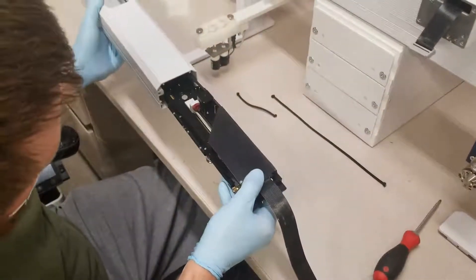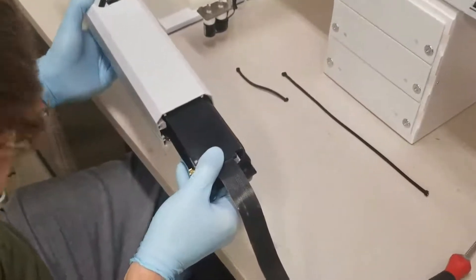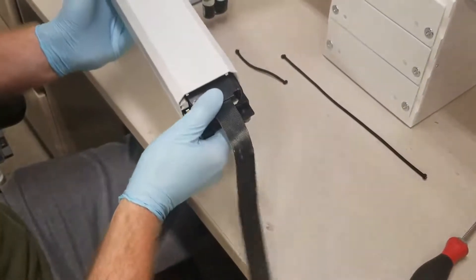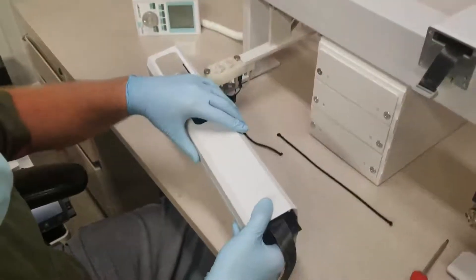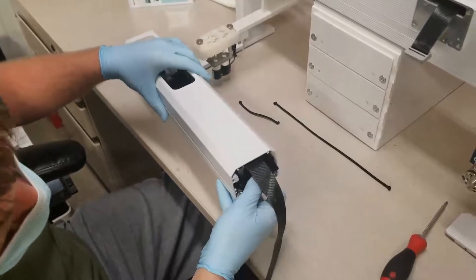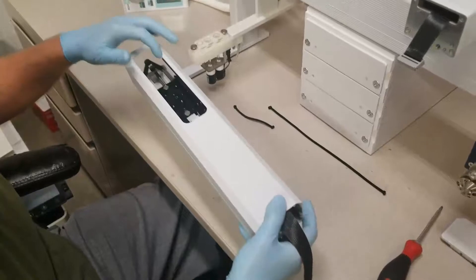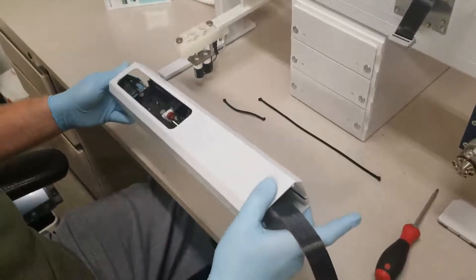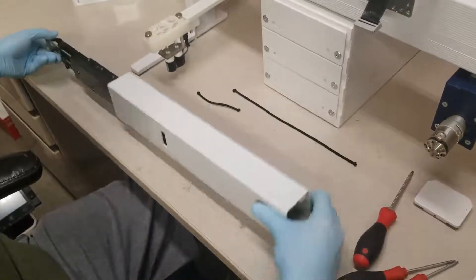Now very gently — you want to take a lot of care when you're doing this. There's a magnet located on the inside of this housing, and if you damage that, it can be a very costly repair. Ensuring that both sides of the rollers are on the guide rails and that the flat cable is moving unobstructed, we'll take it all the way down to the bottom.